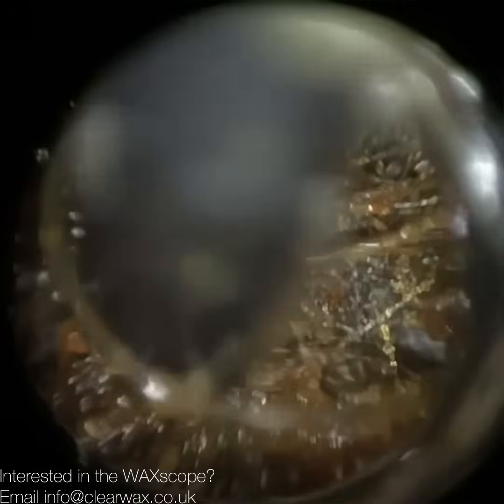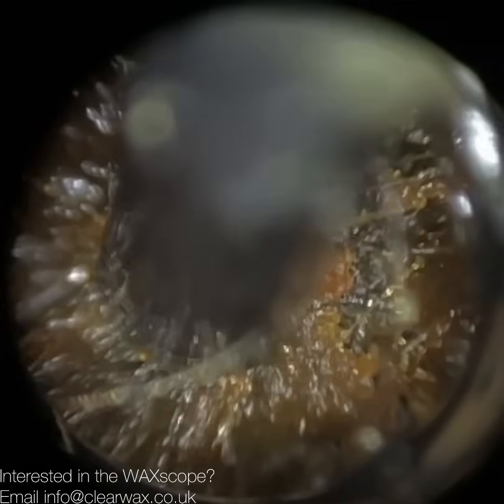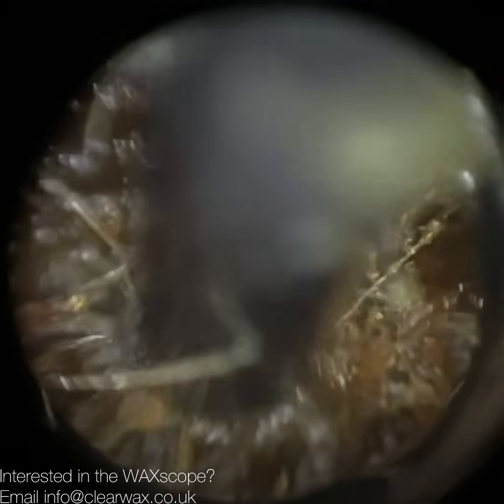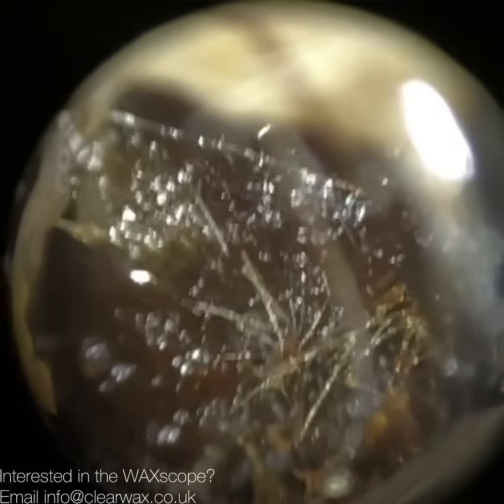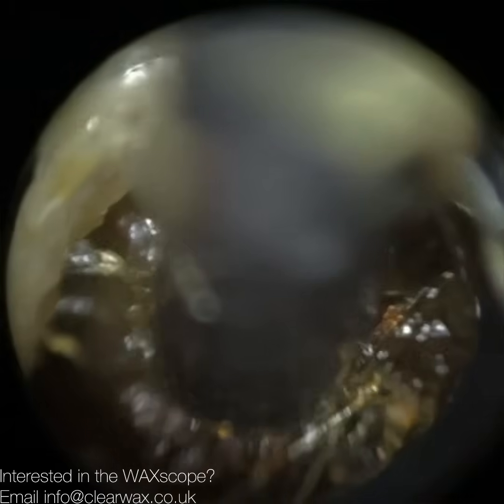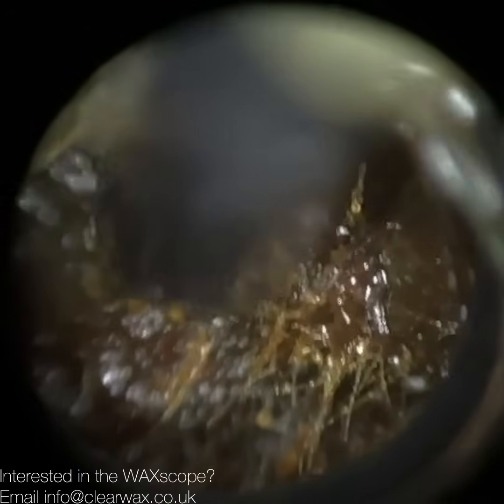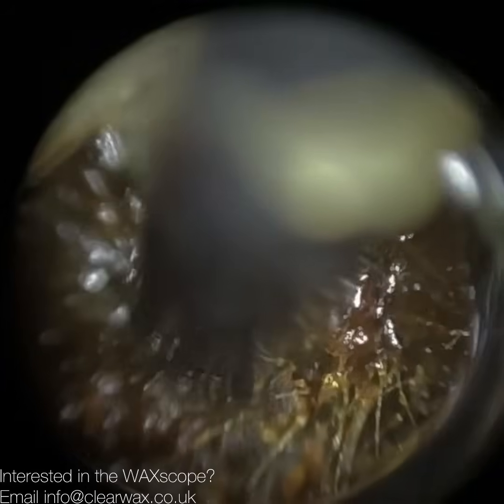So I'm inserting the instrument in that direction. But because that means the speculum is not fully formed, it takes you a while to get used to being able to use it in the same way as a normal speculum that doesn't have an opening. You just have to get your bearings a bit more. It sounds weird, but I think when people first use the WAXscope, they'll understand what I mean. For that reason, I actually preferred using the smaller speculum because it's just a bit more straightforward inserting it into the ear, and even with the smaller speculum, there was still enough space inside for me to work and operate the instrument. But I'm generally using the bigger speculum now.